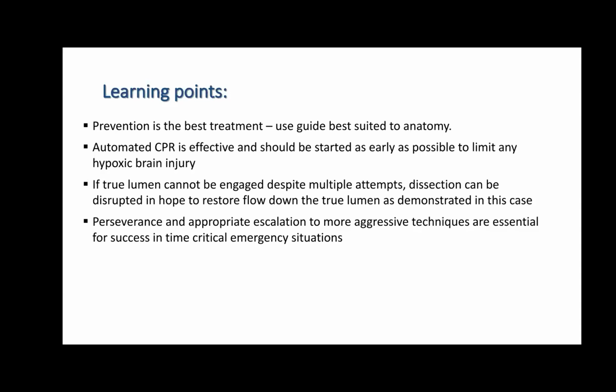Yeah, you can use it. It's softer, and if you have one less traumatic guide wire, then you always have access to the lumen. And B, it does move, it does give you the stability, which can be a problem because of the thoracic inlet. With breathing in and out it does cause significant movement of the guiding catheters via the radial route.